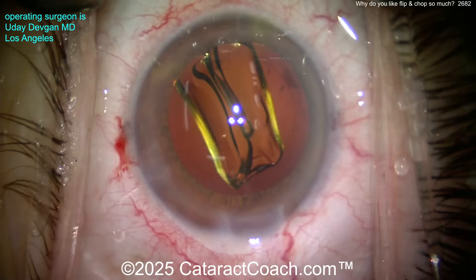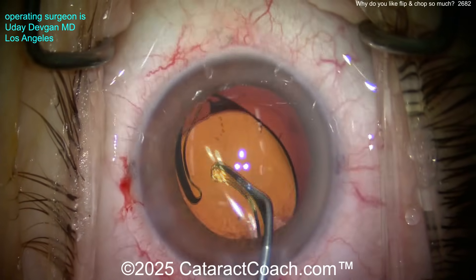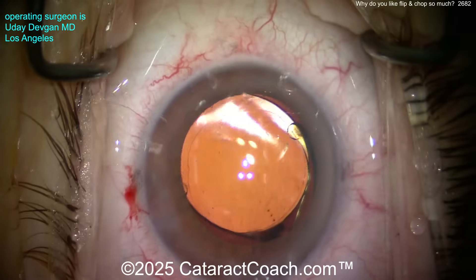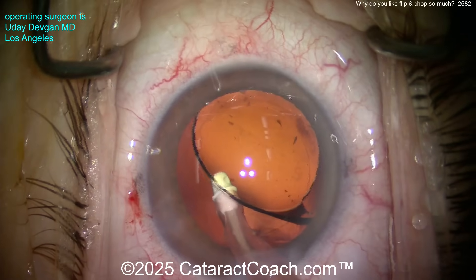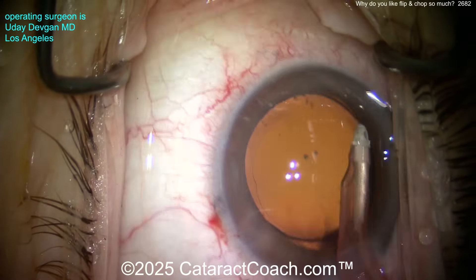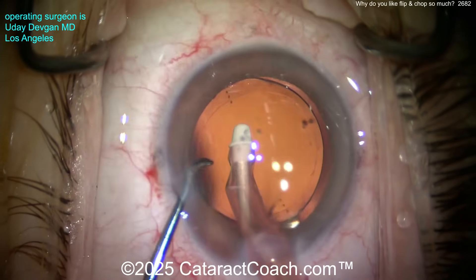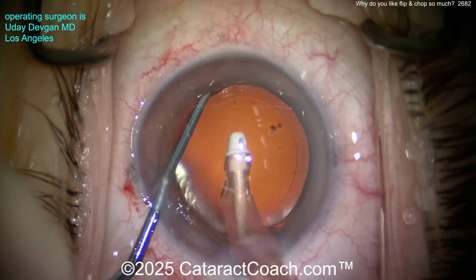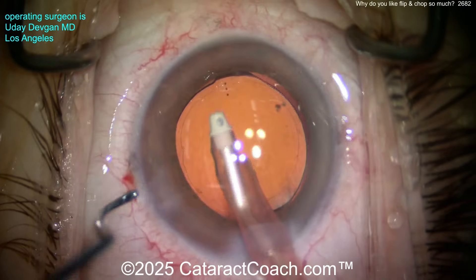Get that delivered nice and easy into the capsular bag. This video is shown real-time and unedited — it's a really efficient procedure. We'll line up the toric marks of the lens with the toric marks on the cornea. At the end of the case, the rhexis will overlap 360 degrees. Now removing the viscoelastic from behind the optic — that's important with a toric lens, because if you leave viscoelastic there it acts as a lubricant and the toric lens can rotate out of position. Look at that overlap — a beautiful rhexis, nicely overlapping the optic for 360 degrees, beautifully centered.